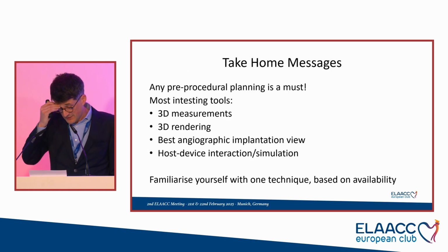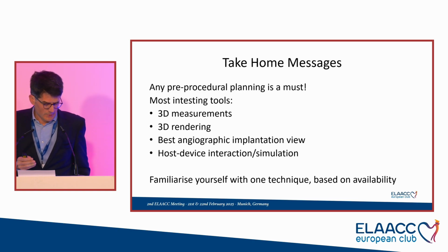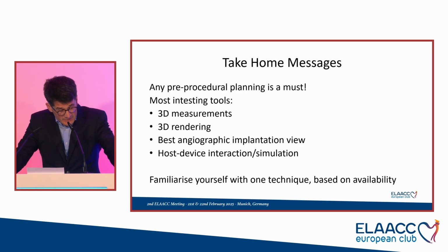So my take-home message, I think any pre-procedural planning is a must. You don't go at sea without a chart. You don't go to war without being prepared. The most interesting tools for me are 3D measurements, the 3D rendering, the best angiographic implantation view, and then, if possible, the host device interaction simulation.